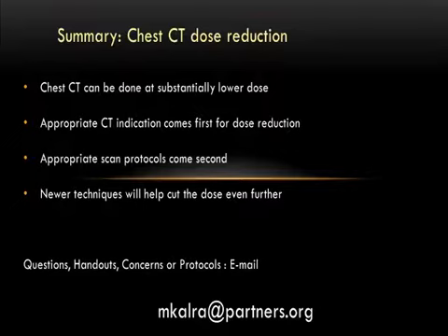And then, of course, appropriateness or justification of clinical indication is extremely important. Once you have decided upon that, you need to make the indication-specific protocols. And then for each individual specific protocol, you would size the dose by using the automatic exposure control technique in most cases. But when you are doing lung cancer screening or lung nodule imaging, you can use fixed mA.